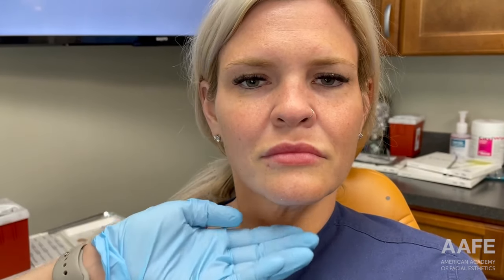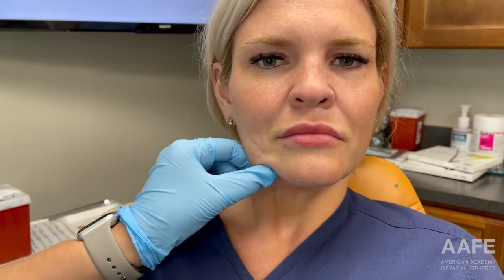Hi, I am Jill in the AAFE Training Center and today we are doing a lifting threads case on our patient. If you want to come in and take a look, I can show you some of the areas that she's mainly concerned with. We have done lifting threads on her in the past, so we're repeating that procedure because she really wants to get more of a lift. We're focusing on the laxity that we see in her lower face.